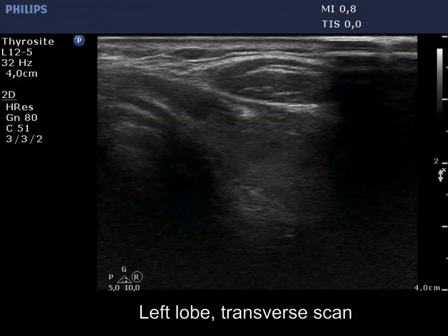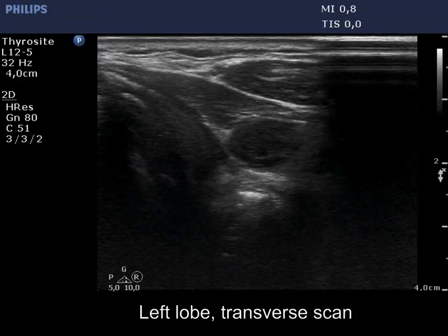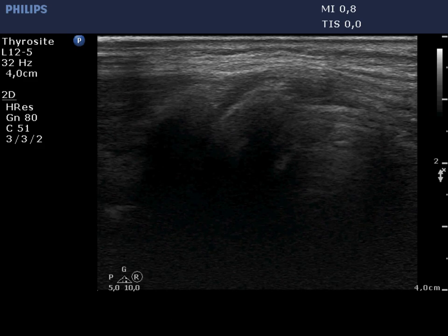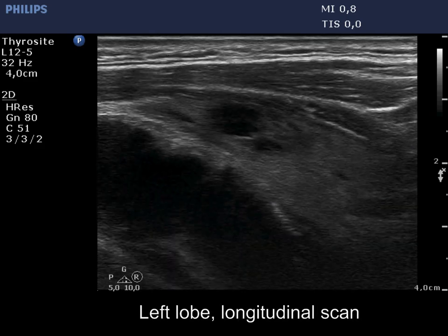The size of the left lobe is normal. This lobe has one relatively large discrete lesion.